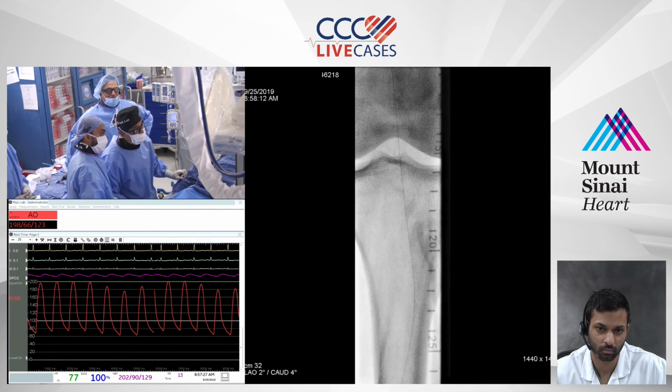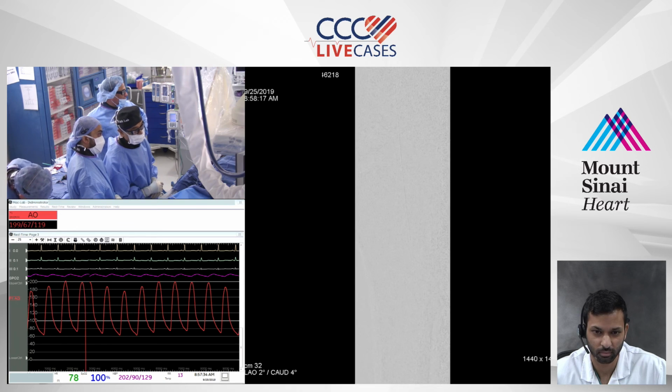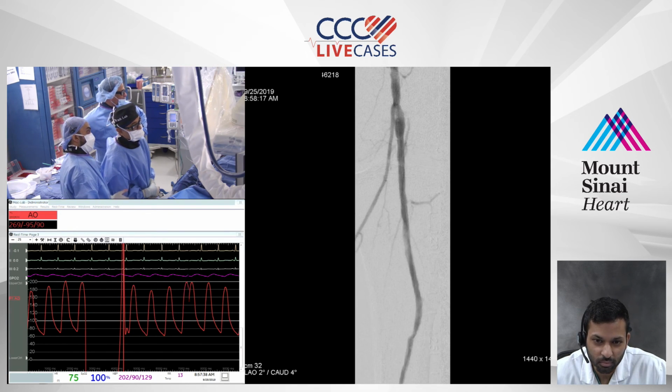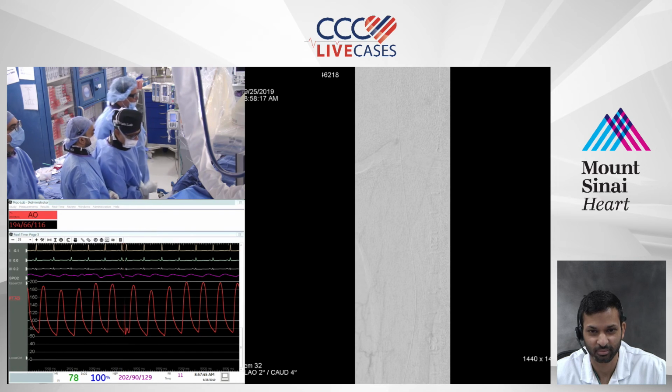So we did our DCB. We're going to take a quick picture here, because I promised you an hour. We're almost at an hour, and I just want to make sure that we can close this up for you. I know you have a big day today at work. You can see there's our nice popliteal. I'm not going to do anything further to that. Go a little lower, please.